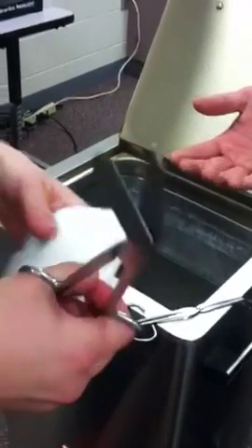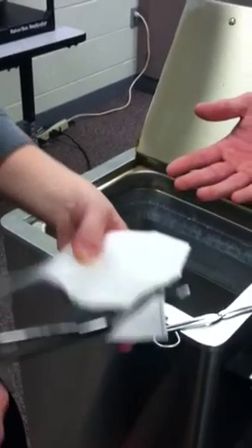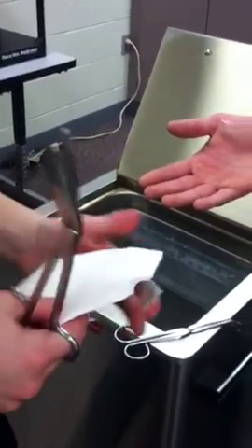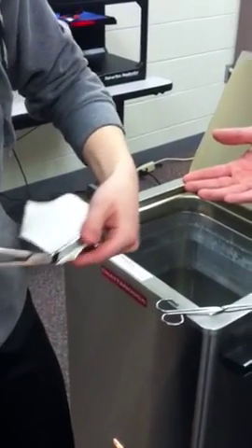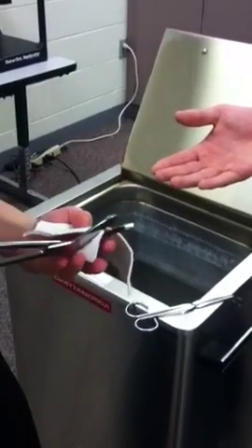Plus, you want to make it nice. You want to make all your corners rounded. You don't want to have any sharp edges. And once you're done here, you'll refit it on the patient once we get the cutting and the corners done. And like I said, this could take 2, 3, 4 times to get this right, but you want to make sure it's correct so that it fits the patient.